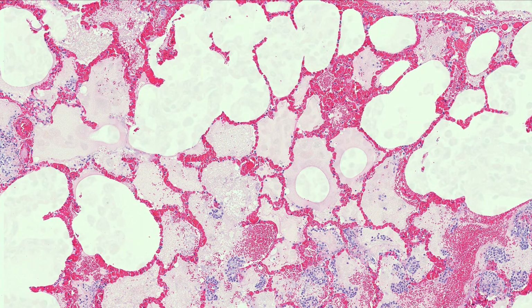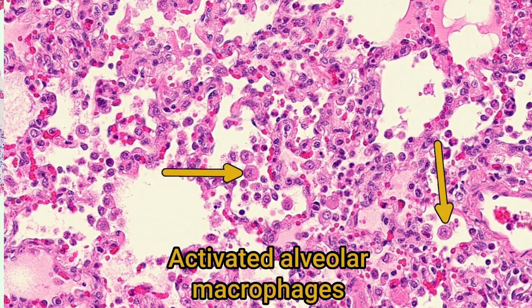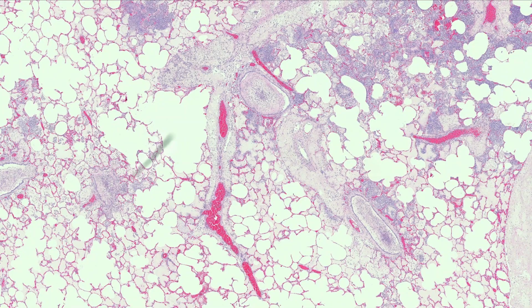The presence of foamy alveolar macrophages is often a reliable indicator of pulmonary edema. You can find them in quite high numbers, these large foamy cells in the alveoli of cattle affected by acute bacterial pneumonia. You might also see what's known as endothelial cell hypertrophy.